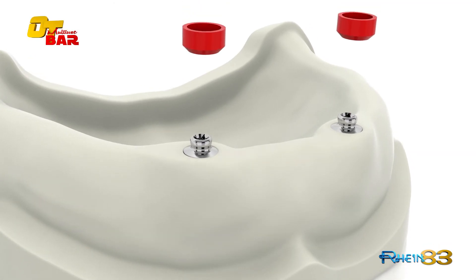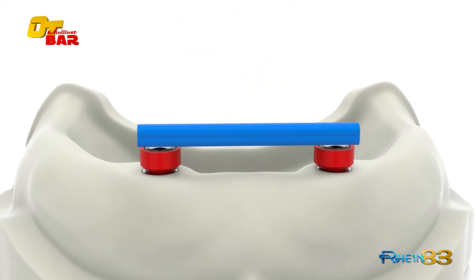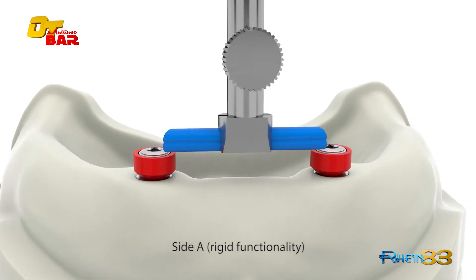Position the castable cylinder for the Seager bar and fix it with the titanium self-extracting screw with peak ring. Position the OT bar with the mandrel. In this case, side A has been chosen, which provides rigid functionality.